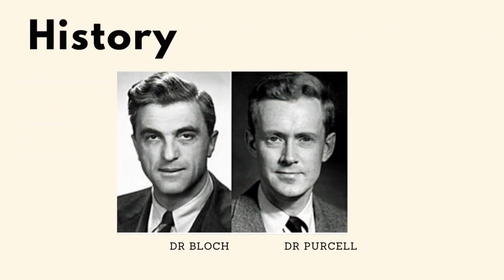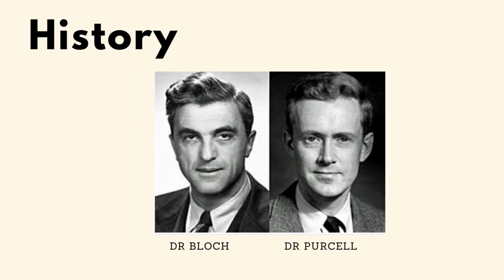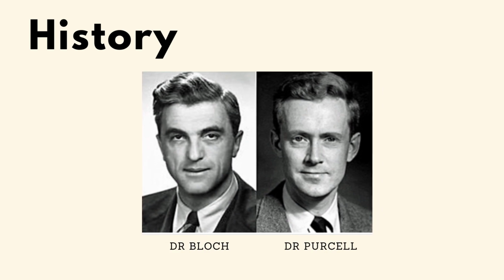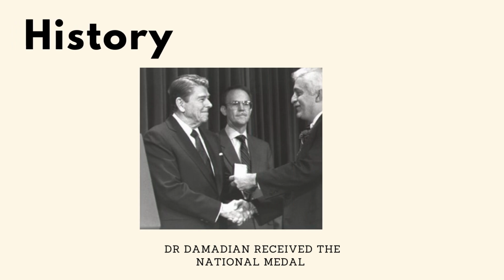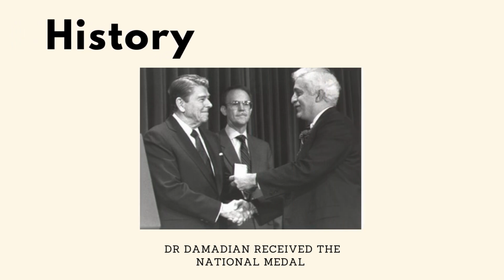In 1952, Dr. Bloch from Stanford University and Dr. Purcell from Harvard University were awarded the Nobel Prize for their work on what was then known as nuclear magnetic resonance, NMR. After 20 years, the word nuclear was dropped and it is now known as magnetic resonance imaging, MRI. In 1988, Dr. Damadian received the National Medal of Technology from President Reagan for his contributions to MRI.